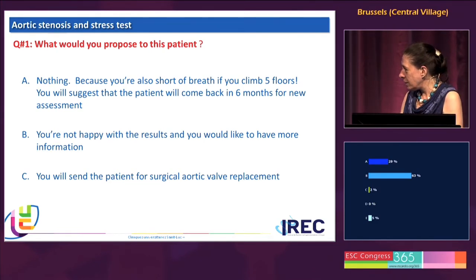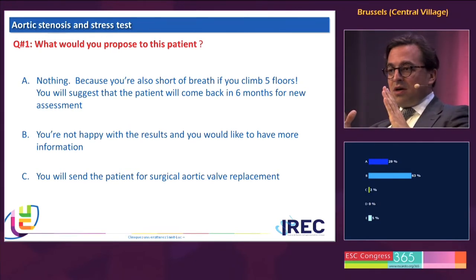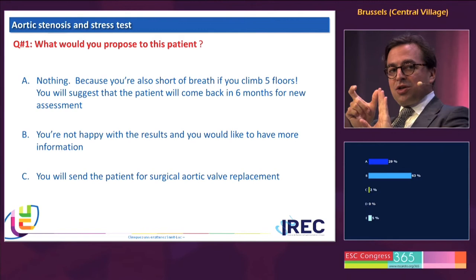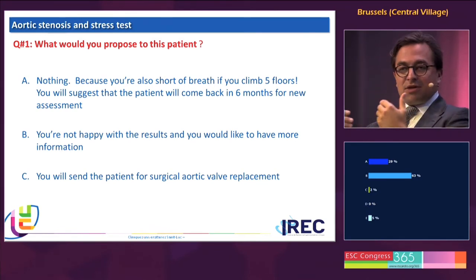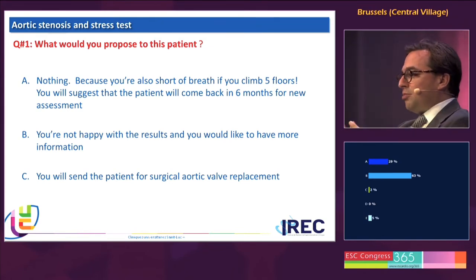I would agree with that, and especially in bicuspid valves, if the valve is less calcified, it sometimes looks as if the valve would open and would be more pliable. But if you measure the separation, it is frequently in the range of 8 to 9 millimeters only, and this will tell you that severe disease is still a very plausible option.